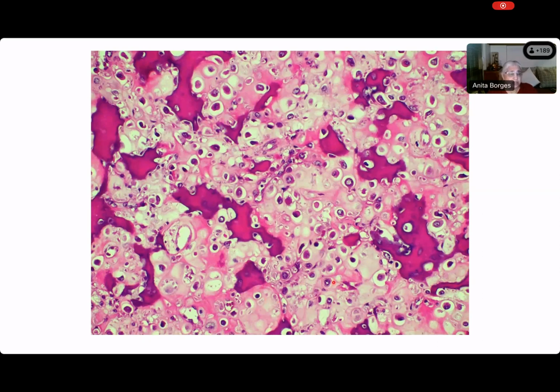They are cells which look clear because the nucleus seems to be sitting in a vacuole. But around each of these nuclei, you actually see a pink cytoplasmic body. Does everybody appreciate that? Can you appreciate it, Sarangi? Yes, ma'am. All right, very good. And you've got this calcification that looks as if it is calcified osteoid, except that in that you are seeing these cells with vacuoles which you would otherwise recognize as being chondrocytes.